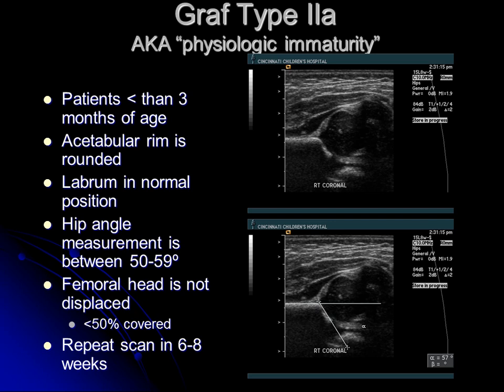The next most common hip I see is Graf type 2A, also known as physiologic immaturity. This is just mildly abnormal, but the child should be less than three months of age. The acetabulum is more rounded as opposed to the sharp contour on a normal study, the labrum is still in normal position, but the alpha angle is low — between 50 and 59 degrees — and the femoral head is less than 50% covered but not displaced out of the acetabulum. We'll just repeat the scan in six to eight weeks, and oftentimes it's normal at follow-up.